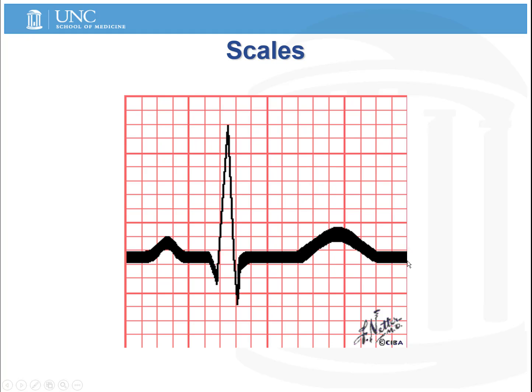And it's possible to measure the electrical activity of the heart with these electrodes that are so far away from it, because the summed electrical fields generated by waves of depolarization and repolarization are large enough to be detected even with these electrodes that are placed on the skin.